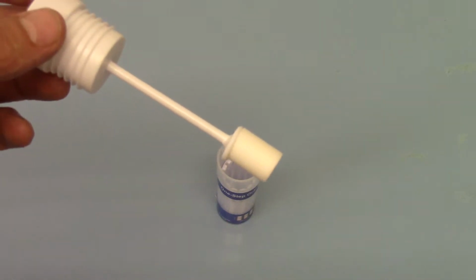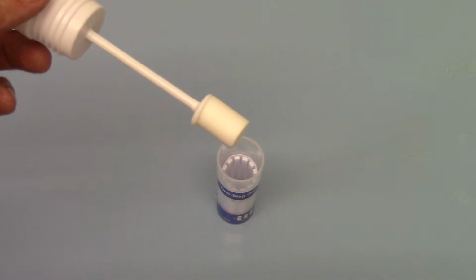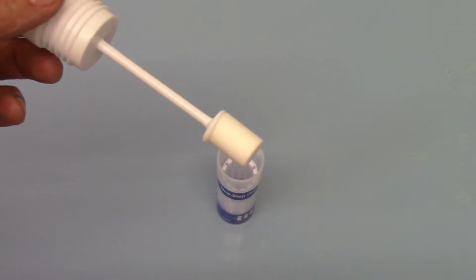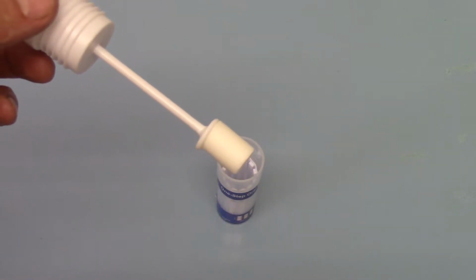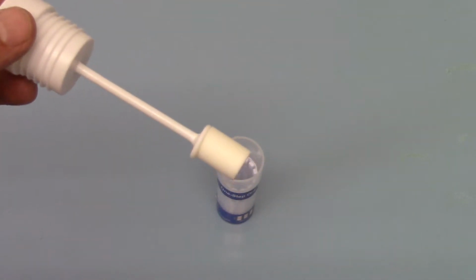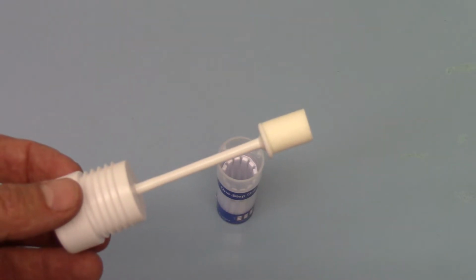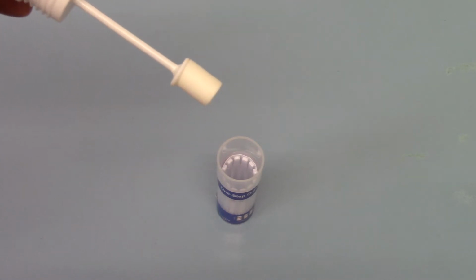You have to get a good volume saliva sample in that sponge to run all 12 of these tests. Too small a volume of saliva, or somebody that's not giving you an adequate saliva sample, you're going to get 1 or 2 of these test membranes running, or in some instances none at all. So a key element of your saliva sample collection is to make sure that that swab gets completely saturated in saliva.